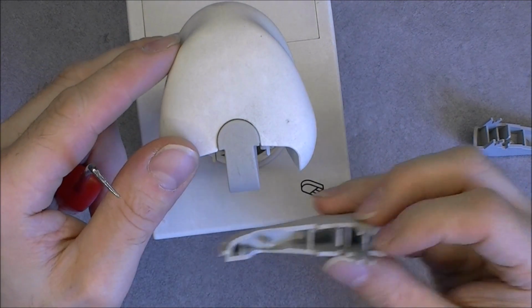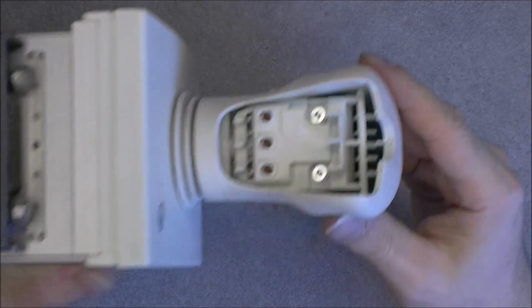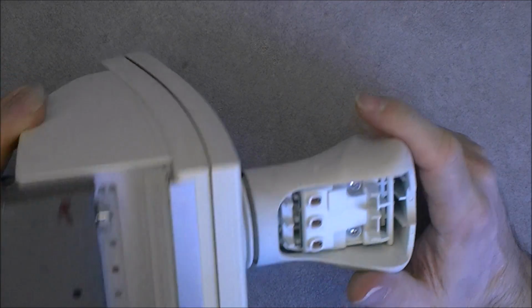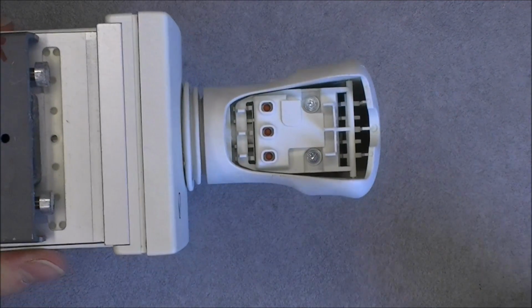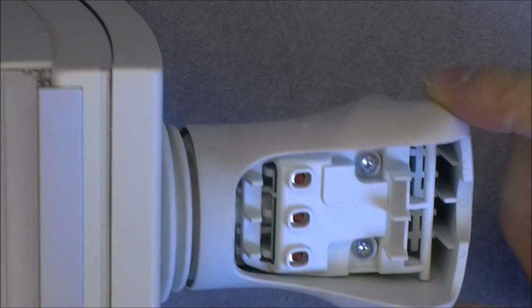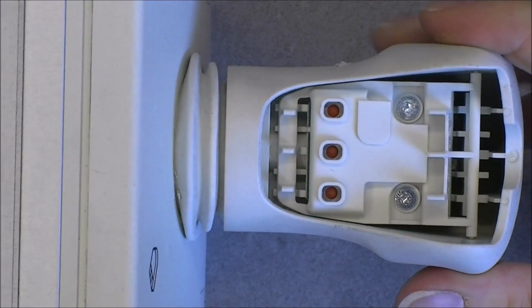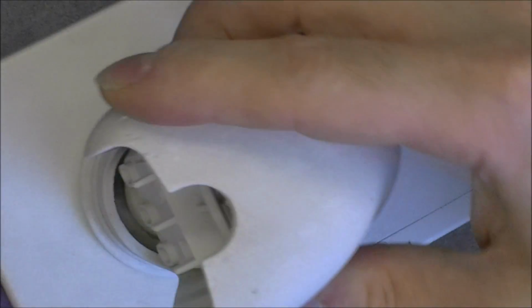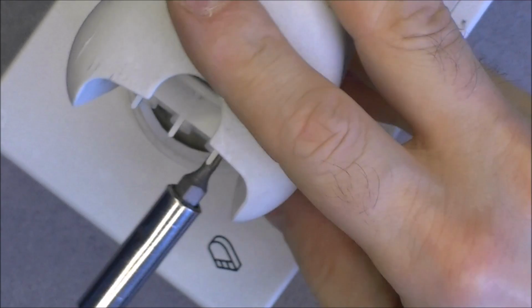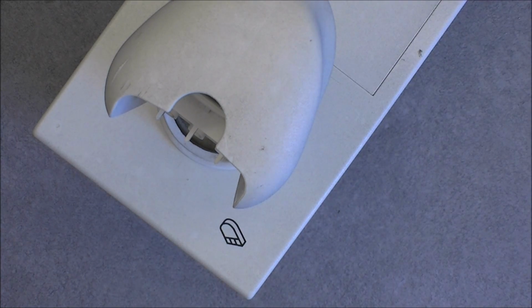Second one, and last one. Okay, it was really easy. So our 3 mouse buttons, we have no scroll wheel as you can see, just buttons, which actually push on these very small parts here. And we have 2 Torx screws. And I see here a mold date code. I cannot read it yet, but let me undo the 2 screws. Zoom a little bit at the same time. Fairly long screws.